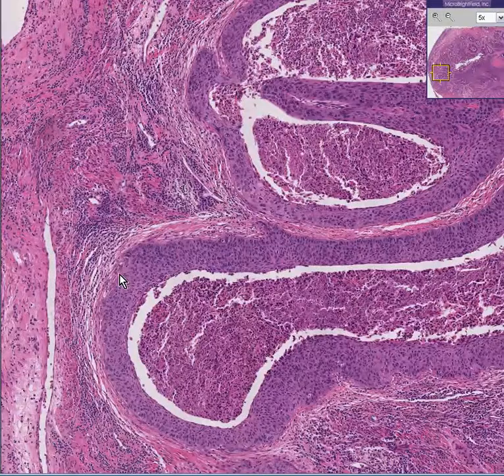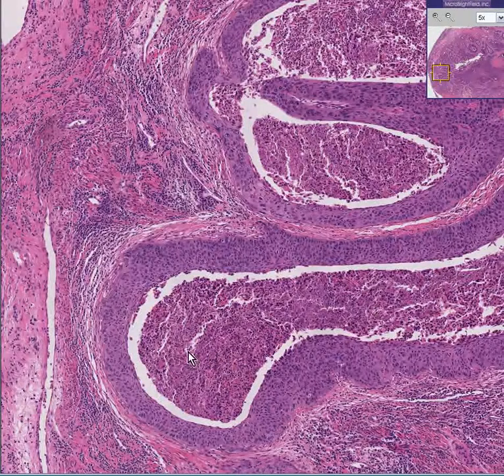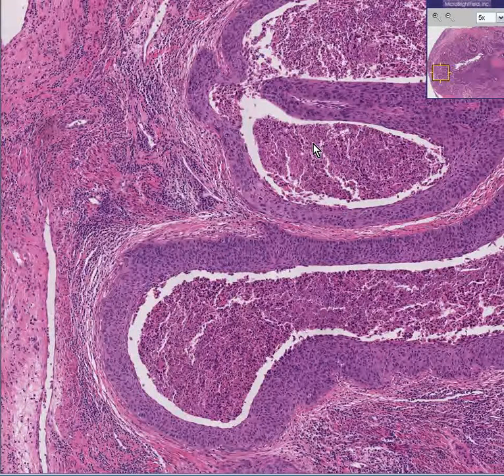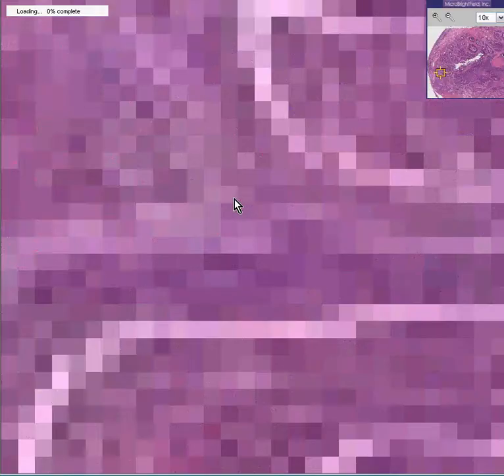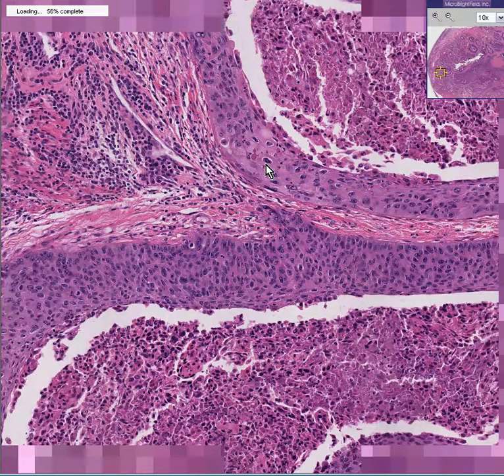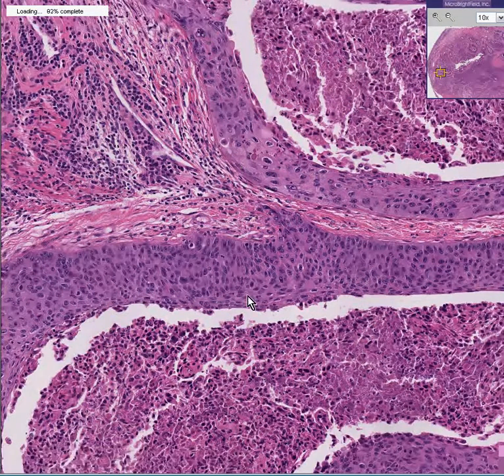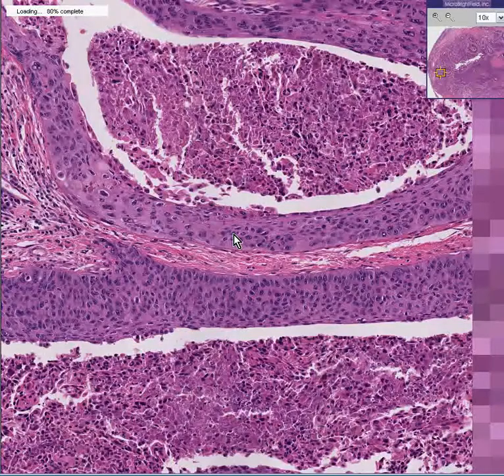And in the middle of it, you have necrotic, perhaps keratinized or inflammatory debris and fibrin. But take a look at the squamous cells in this region. They not only look like coilocytosis, but they are obviously malignant. They're disorganized. There's no maturation. There's mitoses all over the place. You know, perhaps some squamous cell carcinomas are not caused by HPV. Perhaps many, most, or all of them are.